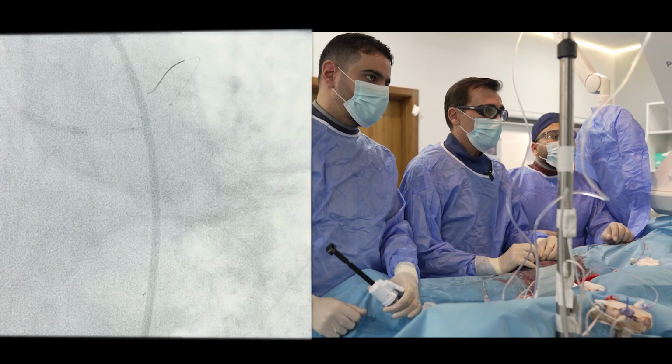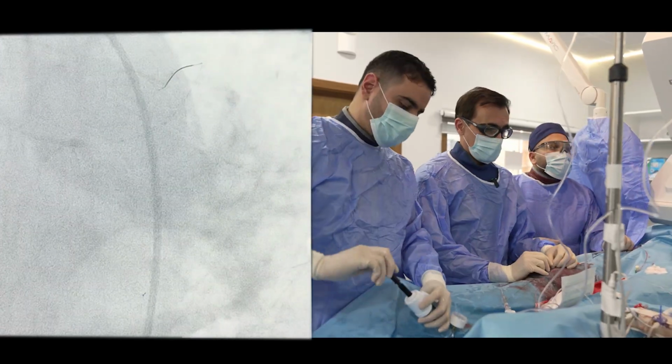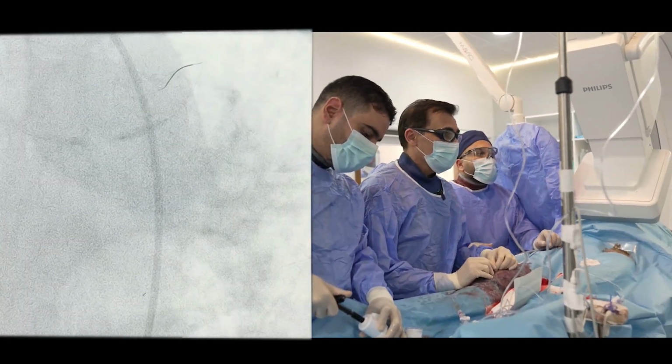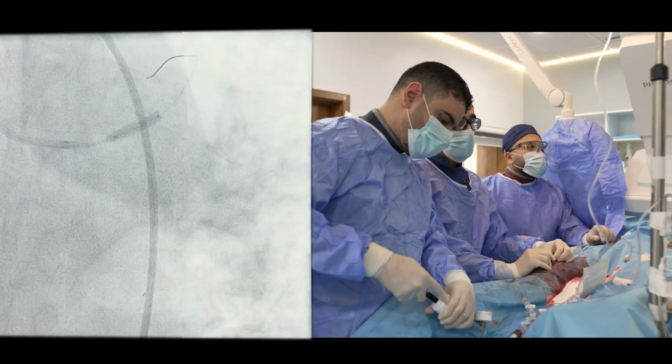I'll pull back the balloon a little. Yeah, go 6. 6. 12. Pressure is coming down. 12. Opening well. Off.